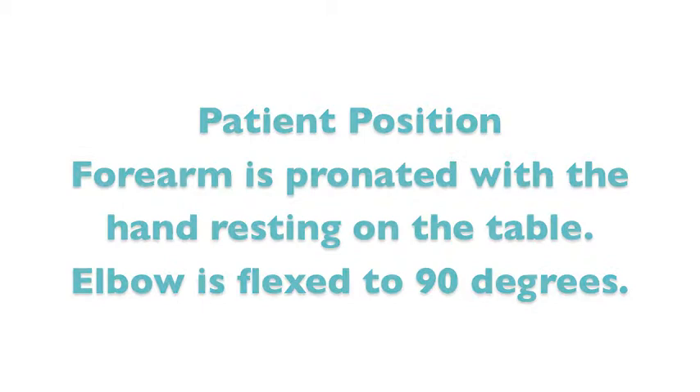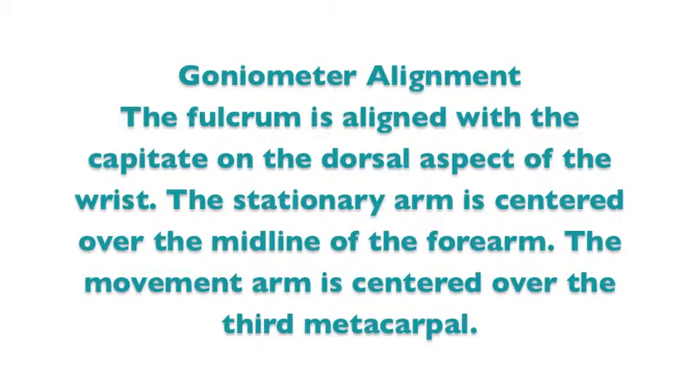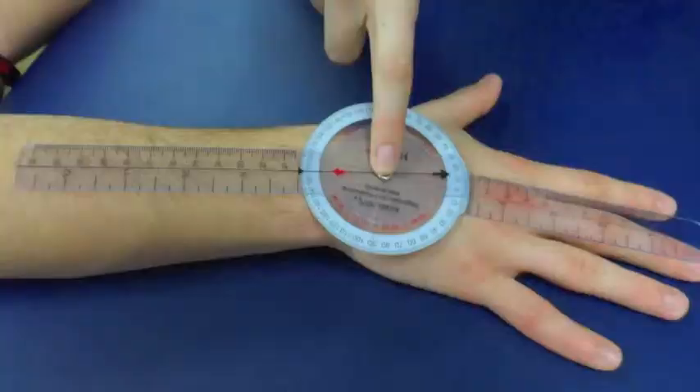Goniometer alignment: the fulcrum is aligned with the capitate on the dorsal aspect of the wrist. The stationary arm is centered over the midline of the forearm, and the movement arm is centered over the third metacarpal.